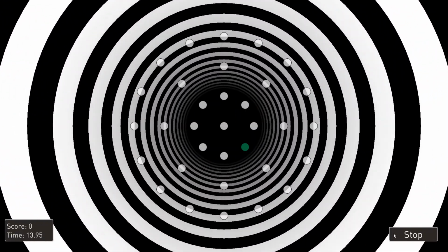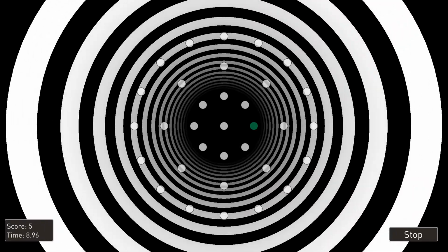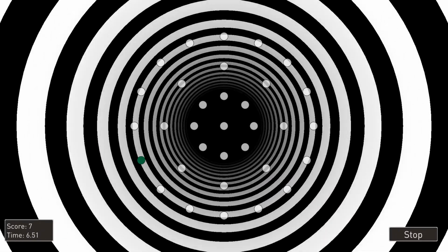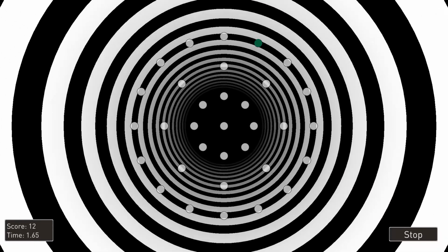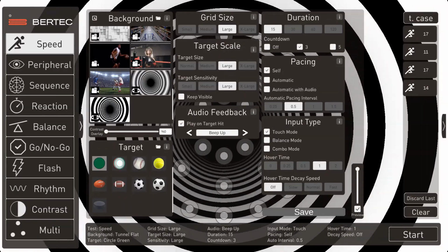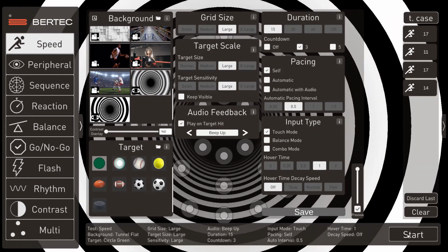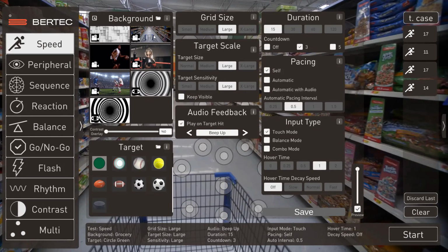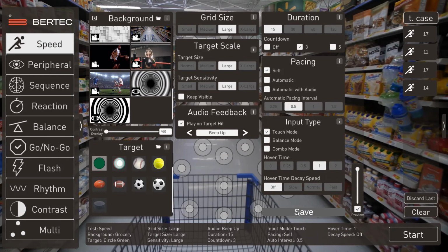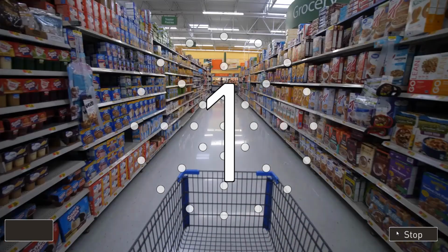While we're doing this, there's a stimulation to the periphery of both eyes to pick up those stripes and to track them out, but then we have to make another saccade at the target. So this becomes quite a challenge, and it really prepares the patient or athlete to return to life and to return to play. And on that note, we bring up the most challenging of all targets for some patients, and that's the grocery store. So we can do these same tasks using the grocery store.